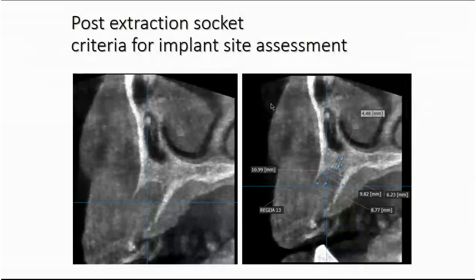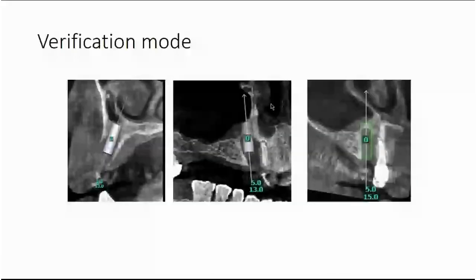And whenever somebody asks you to give your opinion according to one slice or one situation, you should tell him that it's probably a tricky question, and he will present you some issue which is not visible here.